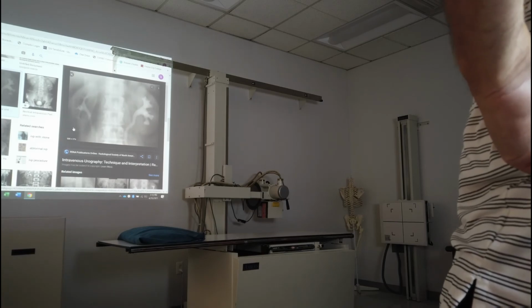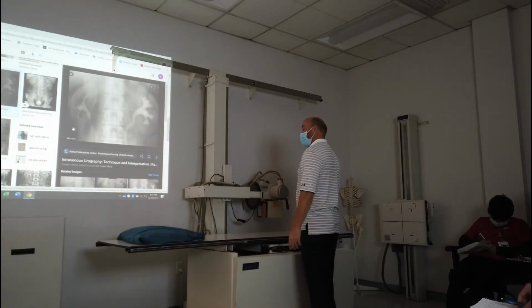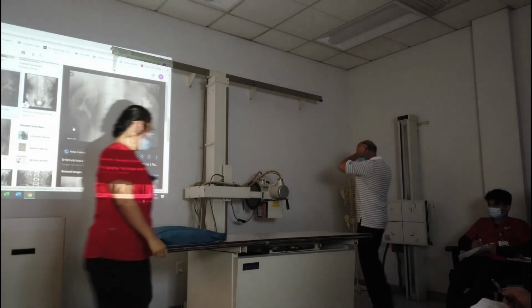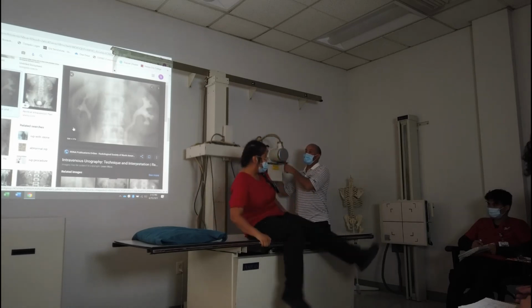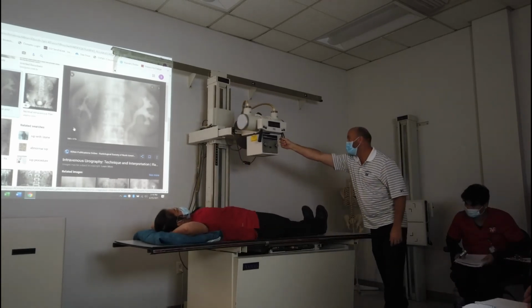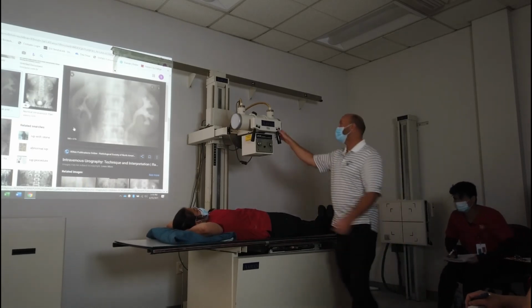But they're pretty easy. All right, Serena, come here. I'm going to use you first, and then I'm going to switch them out. I'll put Noe on the table or something. Come here, girl. Lie on your back. All right. What am I doing? You're going to lie down on your back. All right. Next, ready.